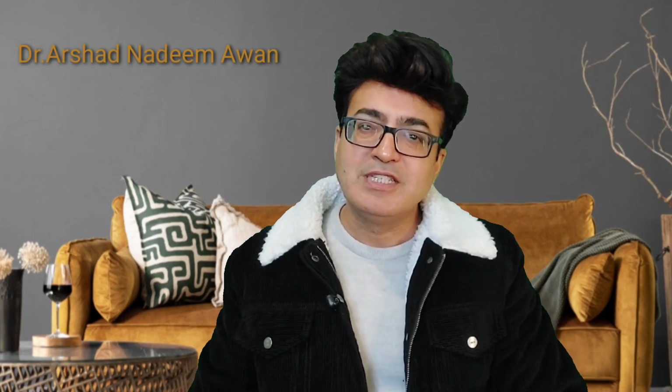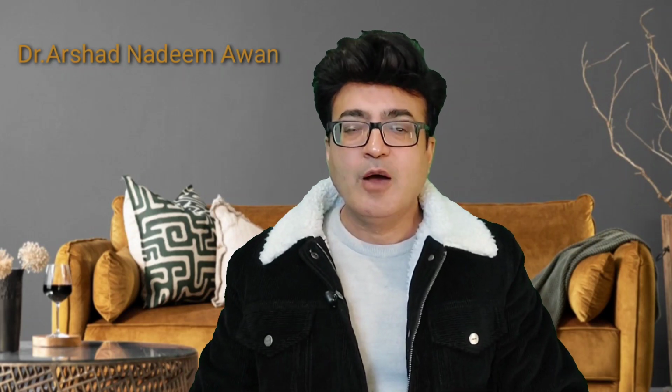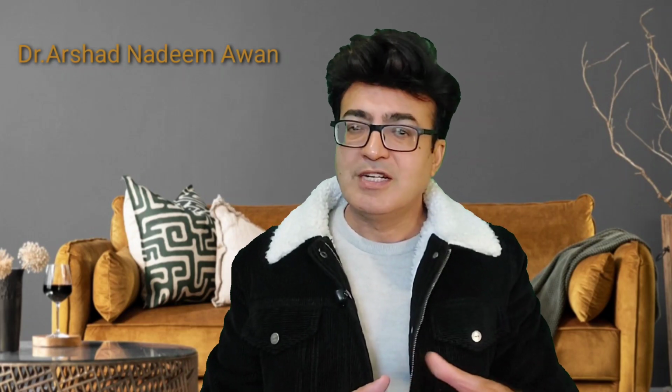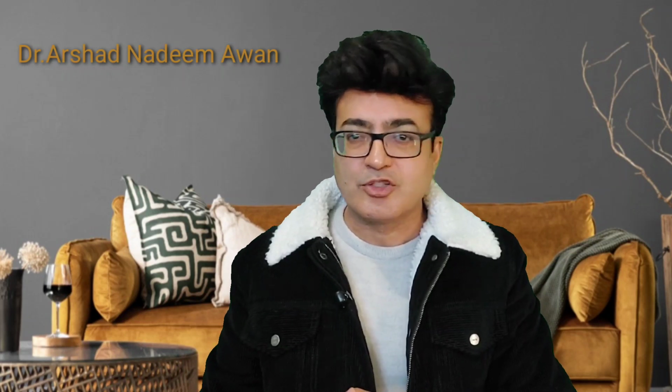How it will appear on CT scan images, how we will appreciate it on X-rays, and how we will look for the differential diagnosis are all included in the subsequent slides. So let's start watching all these slides for osteoblastoma.